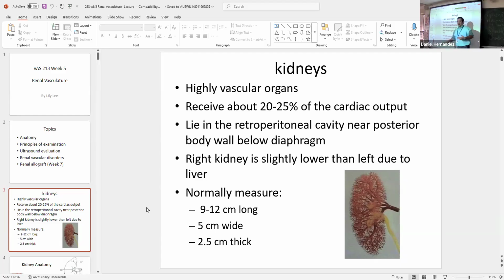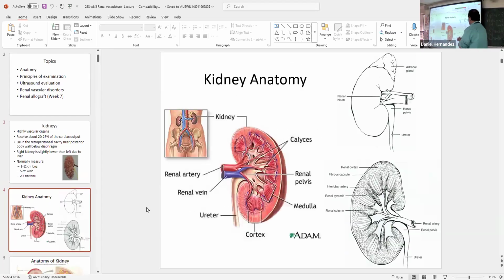Yeah, so we'll talk about the reason why is, possibly there was an issue with perfusion, maybe in utero when the baby or fetus was forming, or in the adult population, if you see a major size discrepancy, there might be infarct going on and poor perfusion that's causing that kidney to essentially start to shrivel or become fibrotic. On the flip side of that, if kidneys are enlarged, very large, it could be an issue, maybe thrombosis, we'll see. But we'll talk a little bit more about lengths, what that could mean.